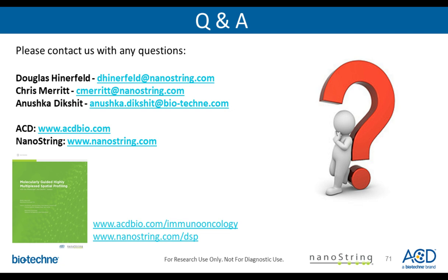Okay, is RNAscope a tissue non-destructive technology? Yes, it does not destroy the tissue when you probe with RNAscope. It is non-destructive, so your tissues remain intact at the end of the assay.